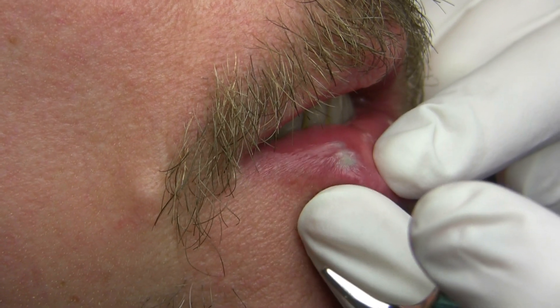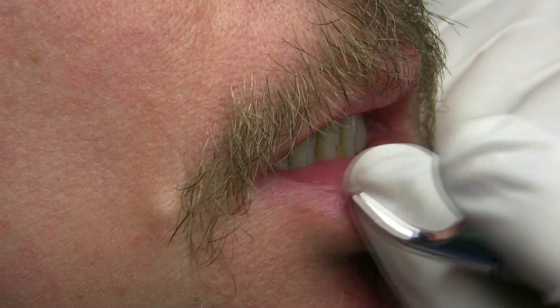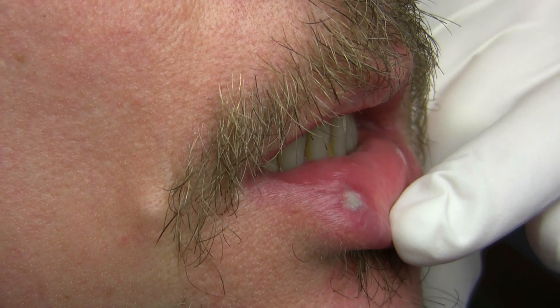So that is gray. And as that heals, it'll just heal over and fall off, and usually is done in one treatment.